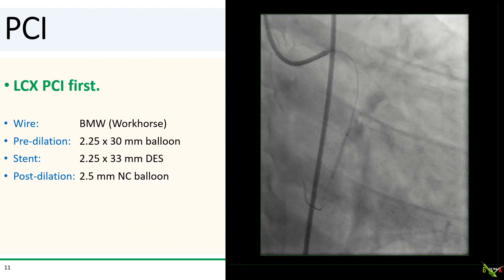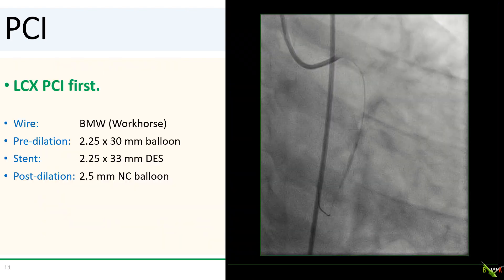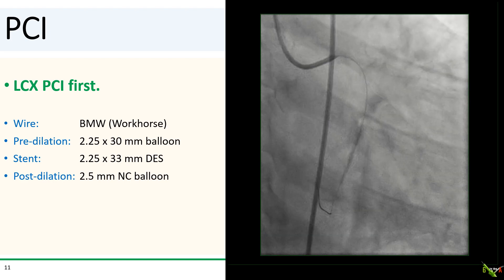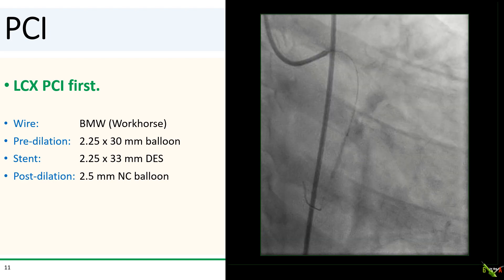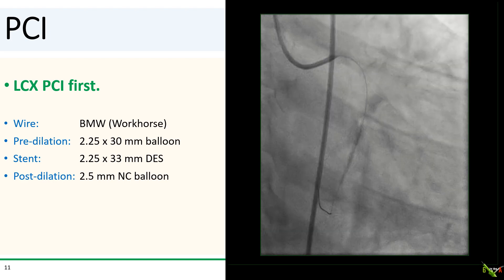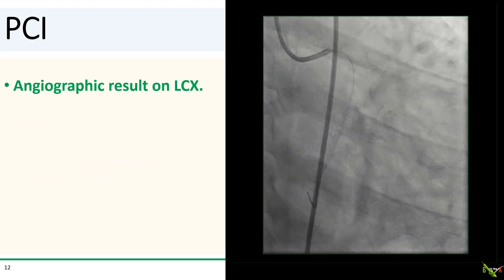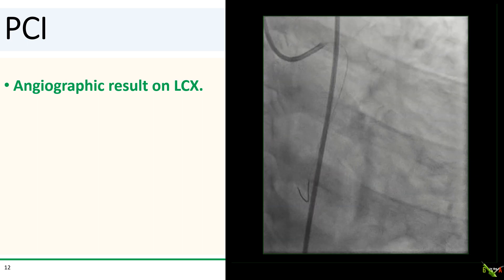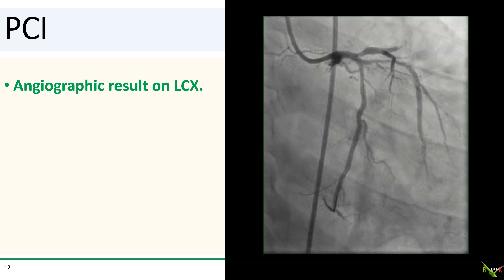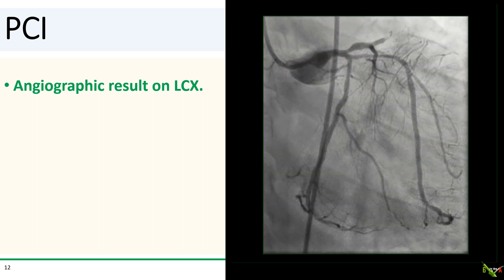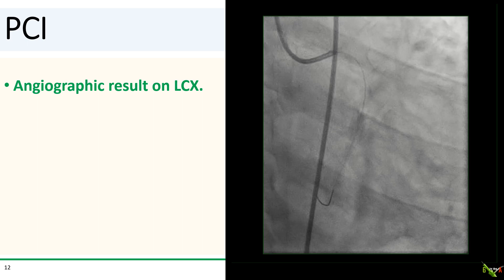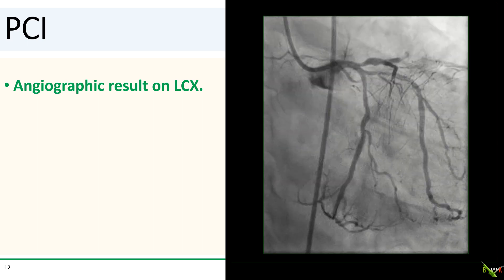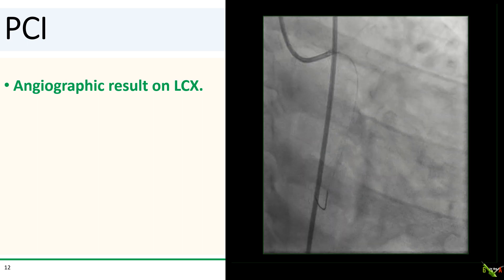The circumflex went first and, as predicted, it was straightforward — balloon, stent, balloon. After a 2.25 by 33 millimeter DES, here is the angiographic result in the circumflex. The OM was jailed but remained angiographically unchanged.